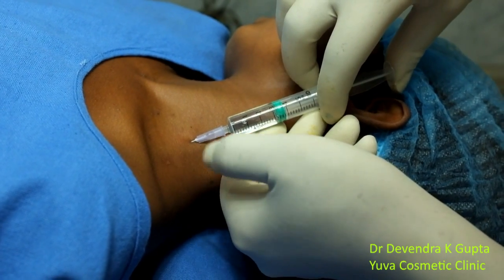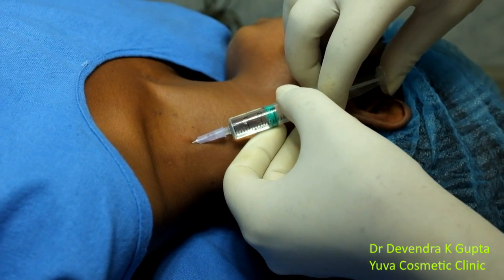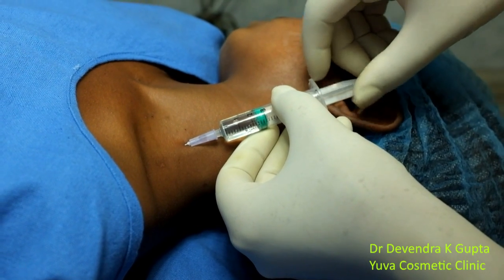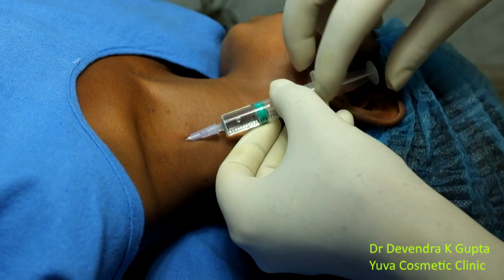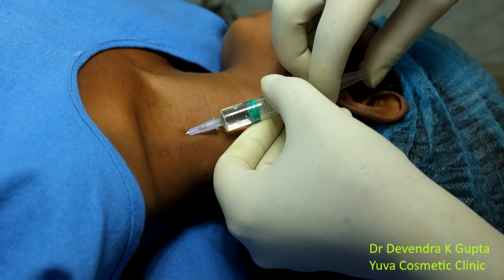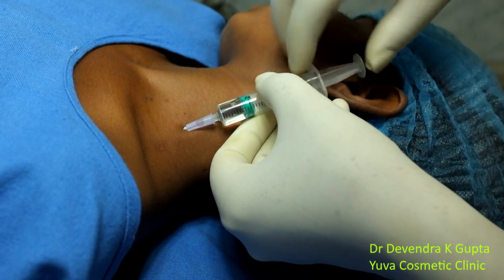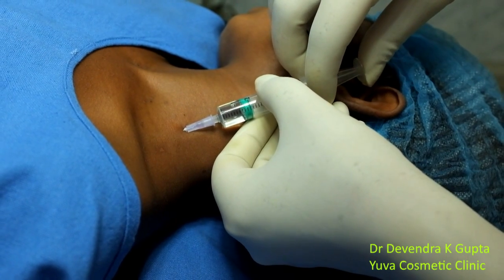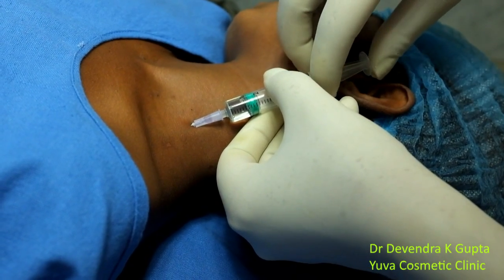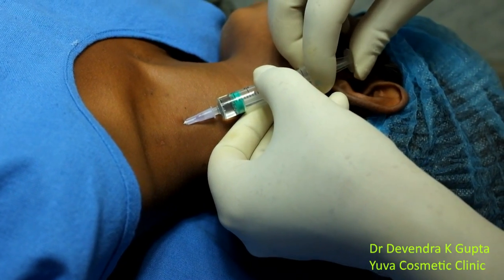The aim is not to touch the brachial plexus nerve roots or trunks here. Gently inject, aspirate — sometimes we have to rotate also. Rotate, aspirate, and then inject; make sure there is no resistance. This block is essentially painless unless you are touching the nerves. I am just ballooning the space that surrounds the brachial plexus — that is the brachial plexus sheath.